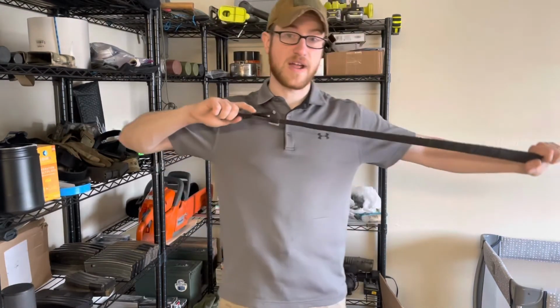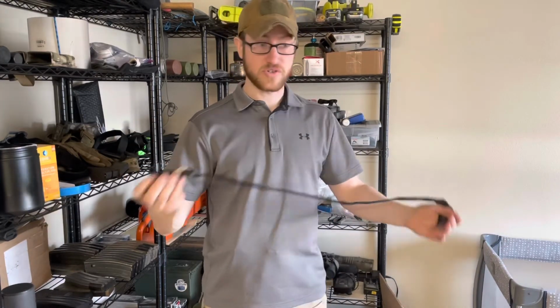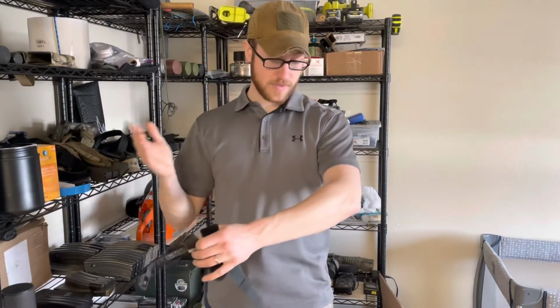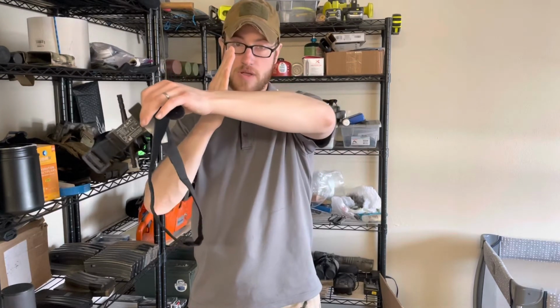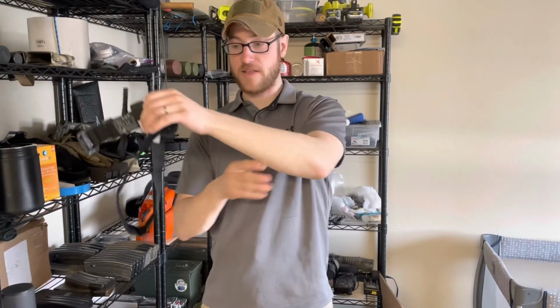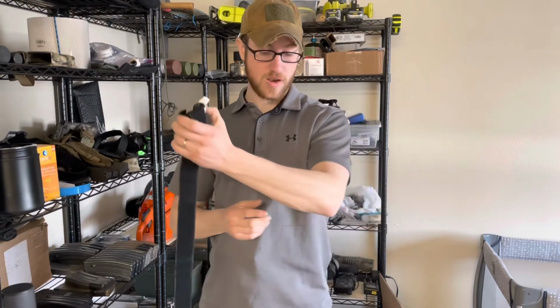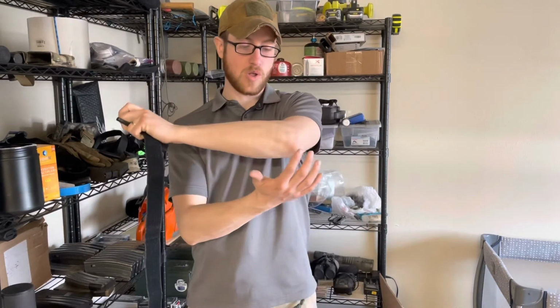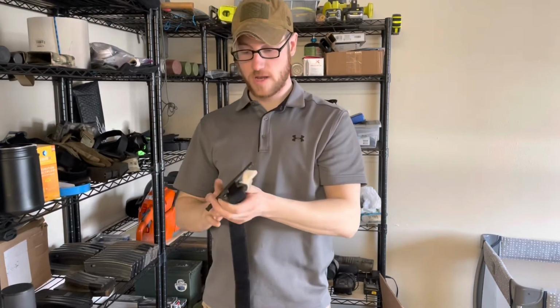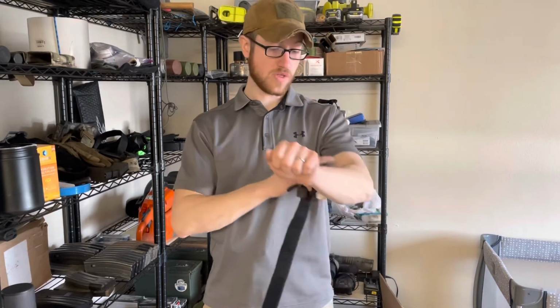If you are not under fire and your security situation is lesser than it would be under fire, then there's no reason not to do a proper tourniquet application. So let's say you have a cut off wrist right here, well then you can come 3 inches high and do your tourniquet right there. And the reality is, and I learned this the other day to be truthful, I was taught that you can't put a tourniquet below this joint because there's 2 bones, the artery runs between them. That is false.